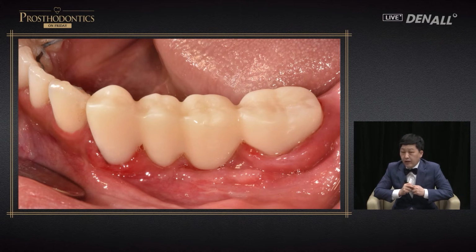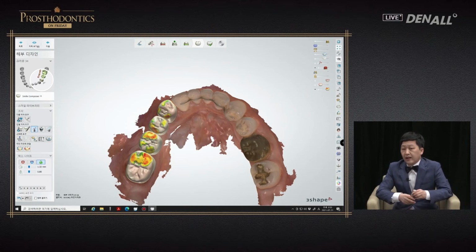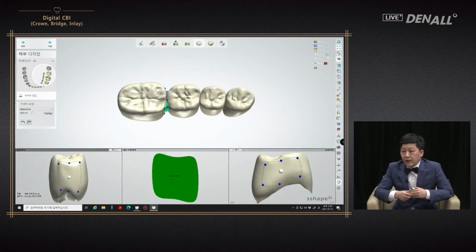The patient should be able to use Proxa brush. The patient had been doing orthodontic treatment for a long time, so there was inflammation. I thought this could be an issue. In number 7, mesially, the size was too big, and number 6, it was slightly tilted towards mesial side. So I looked at how the crown was designed and provided feedback. And number 7 was slightly more over contoured. If you look at the joint, it was designed like this. It was too inferior.